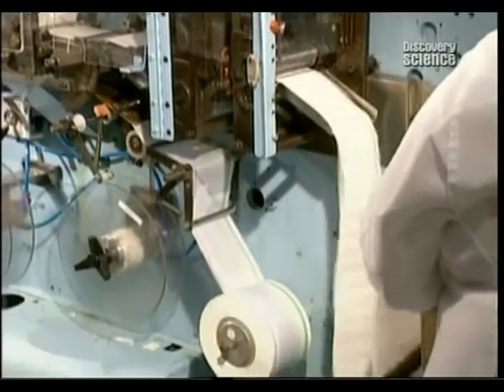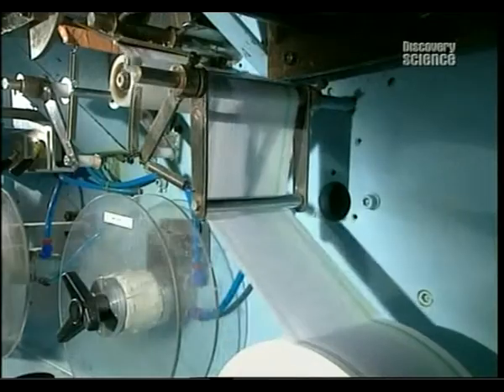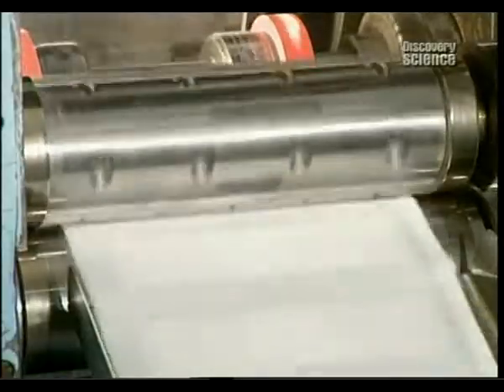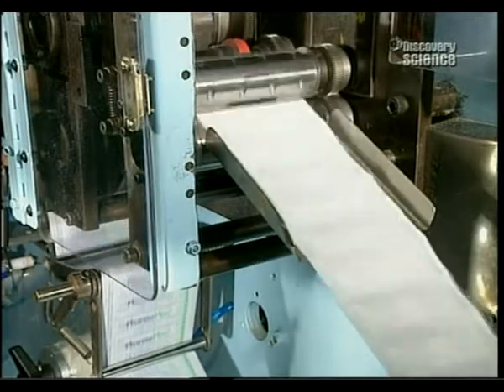And now they proceed to packaging, where between 300 and 1,500 plasters are wrapped per minute. This roller perforates holes, which allows the plasters to be easily separated from one another.